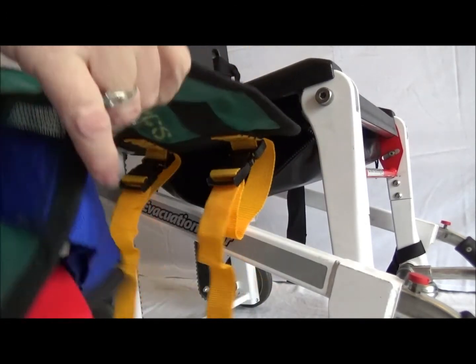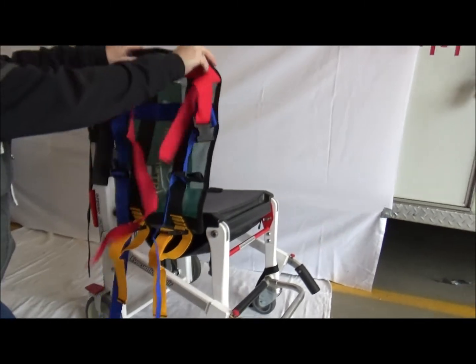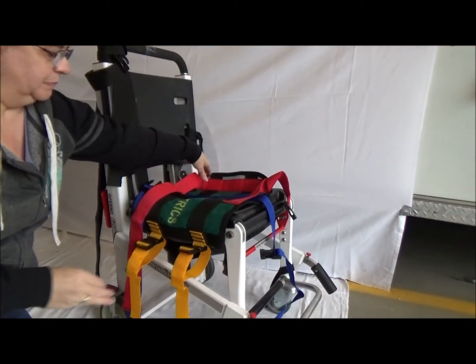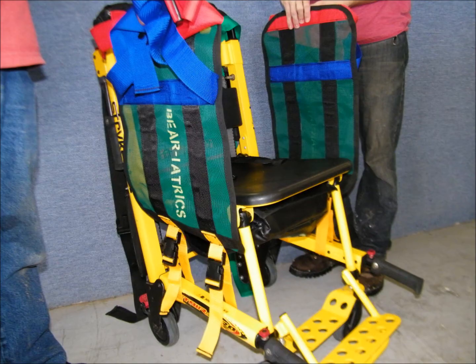Now you are ready to connect the frame straps. After the left and right side are deployed, connect the yellow frame straps to the bottom frame of the stair chair as shown.